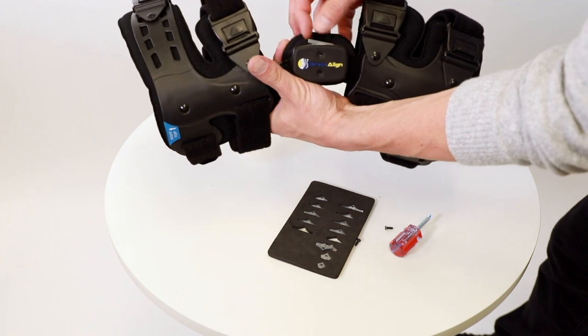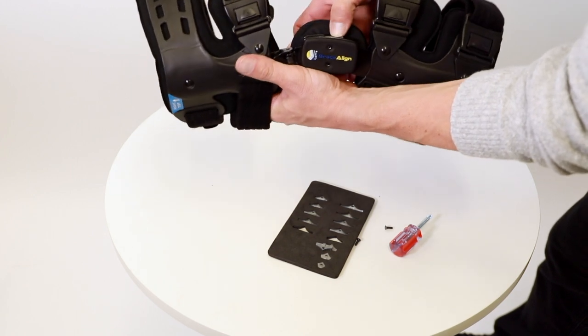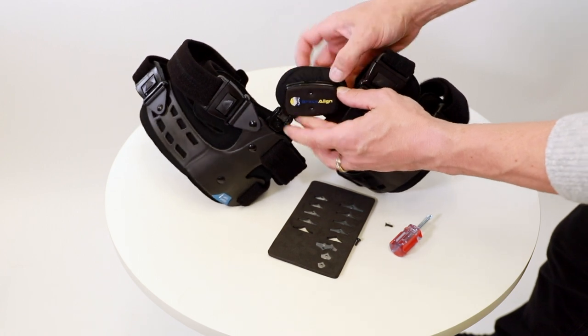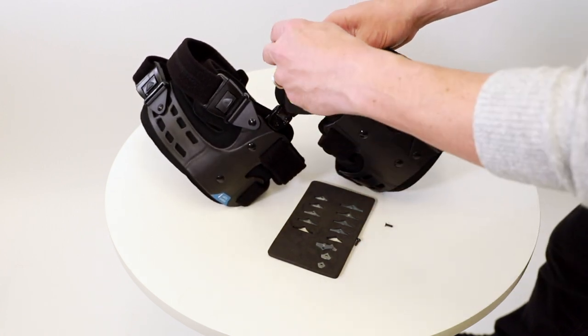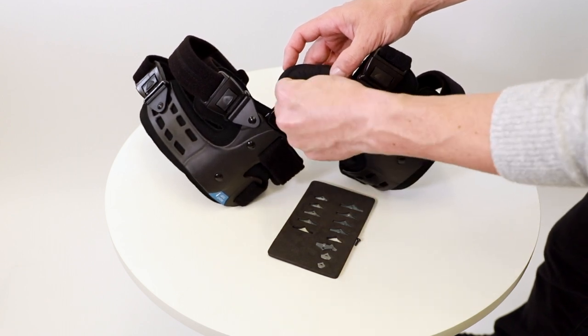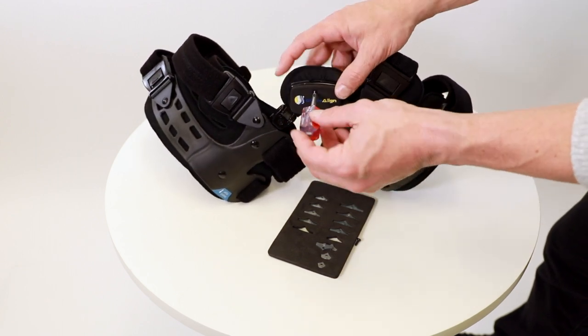Drop the stop into the hinge and tap it down into place. Replace the screws on the hinge and tighten back into place.